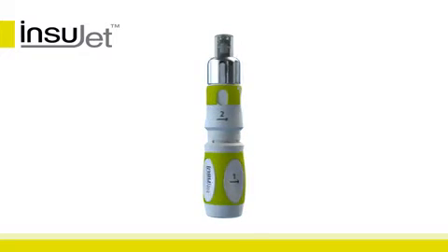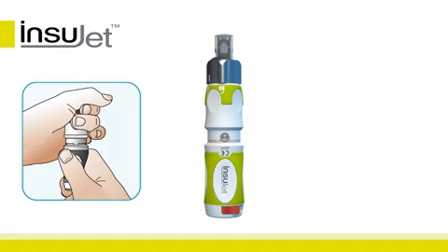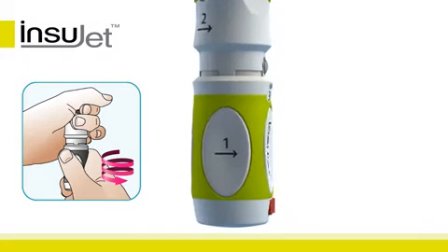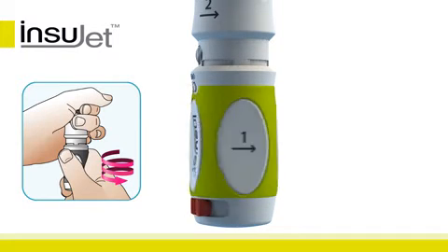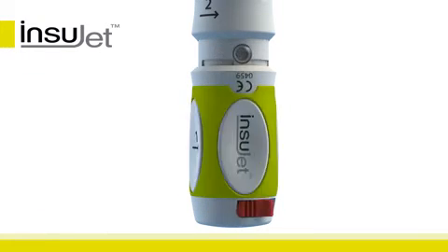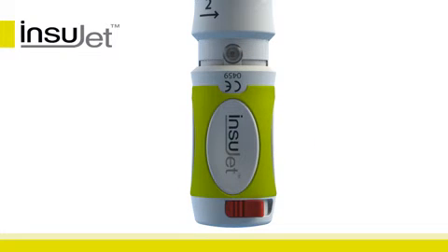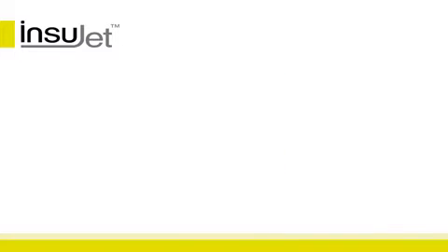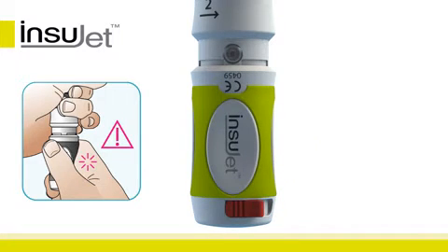We'll first show you how to charge the Insujet. Hold the device in both hands. While holding the tip of the device stationary, start rotating the back in the direction of the number one arrow. You will hear and feel a click when the back of the device is rotated approximately one turn past the zero mark in the dosage window. Always charge the Insujet before you start taking up insulin.